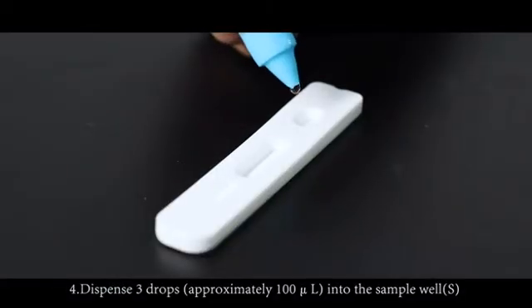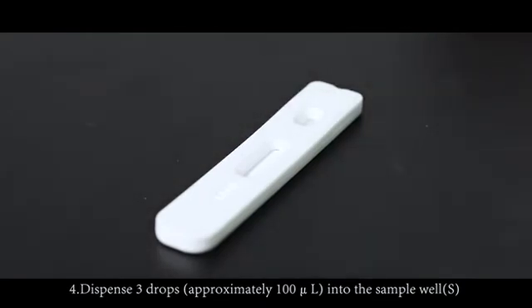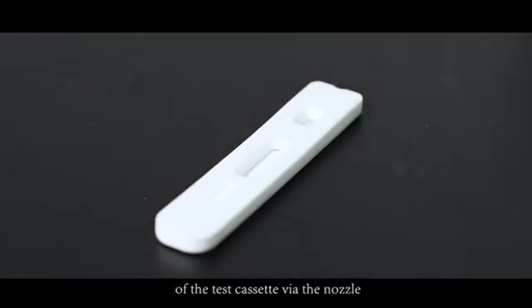Step 4: Dispense three drops, approximately 100 microliters, into the sample well.